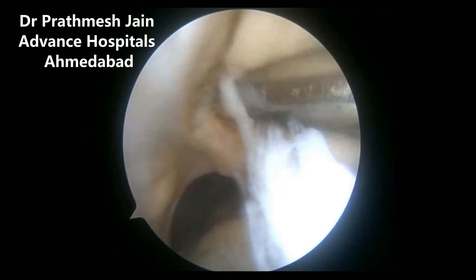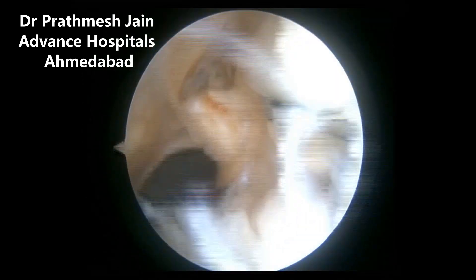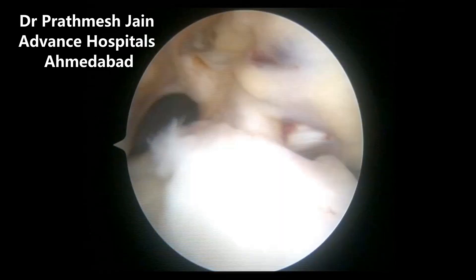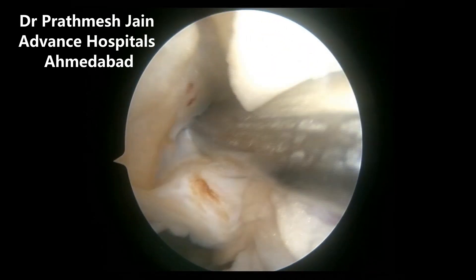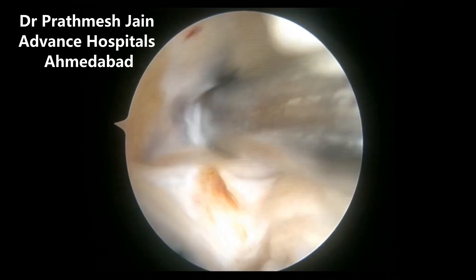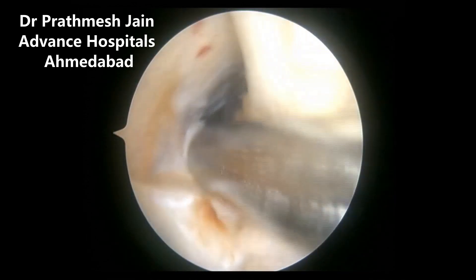or femoral tunnel. In this patient, a 10-year-old male child who has suffered ACL injury while playing football, we are treating the same with the iliotibial band ACL pediatric reconstruction without drilling any tunnels.